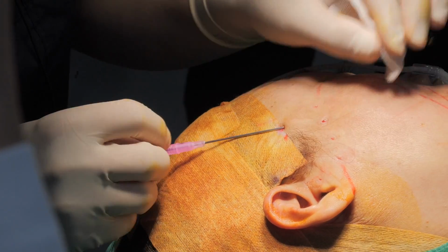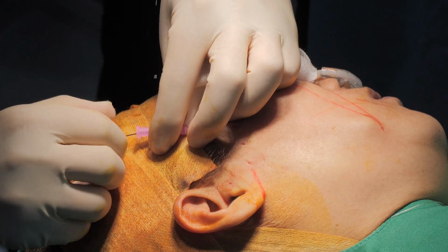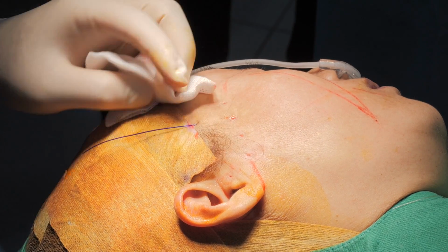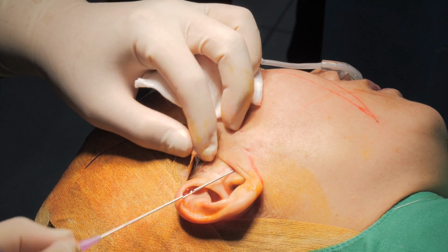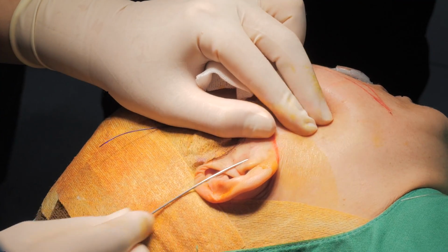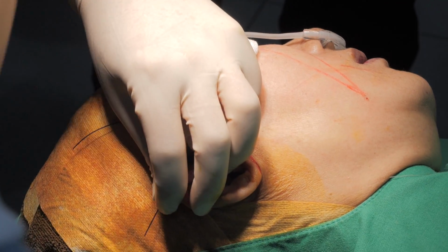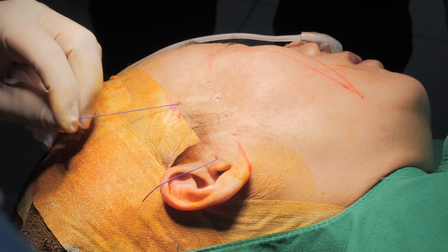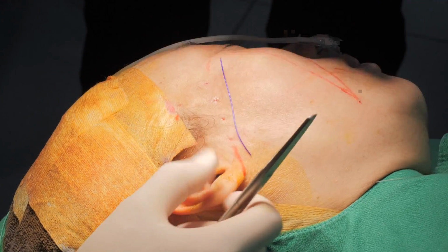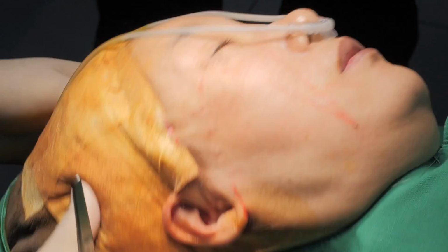I can insert the thread from the hairline to the jowl directly to correct the jowl. One more thread from the anterior point of the tragus. Not too deep, not too superficial. Actually, it's enough, but I will add more for the presentation.